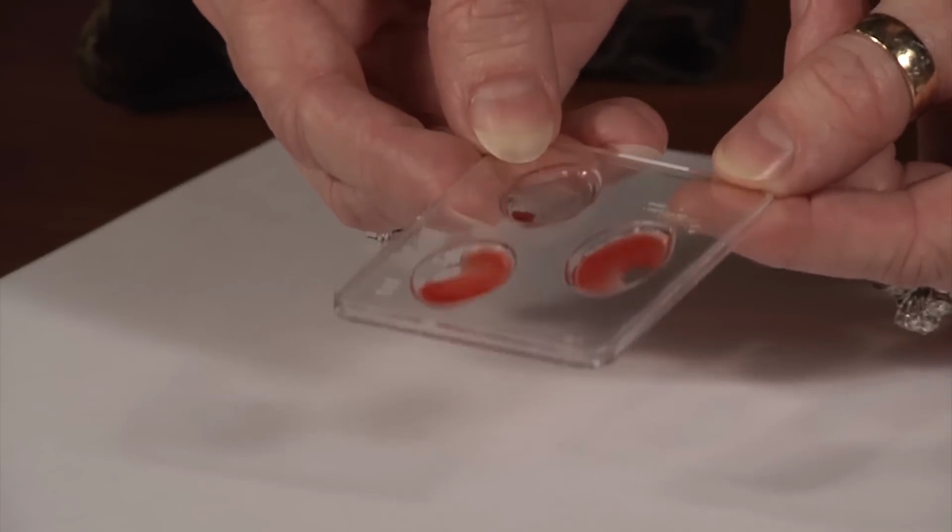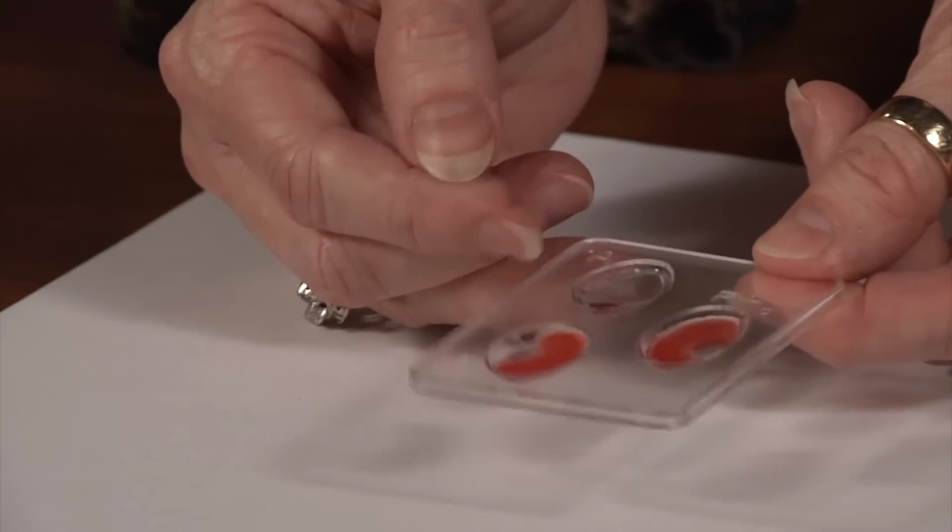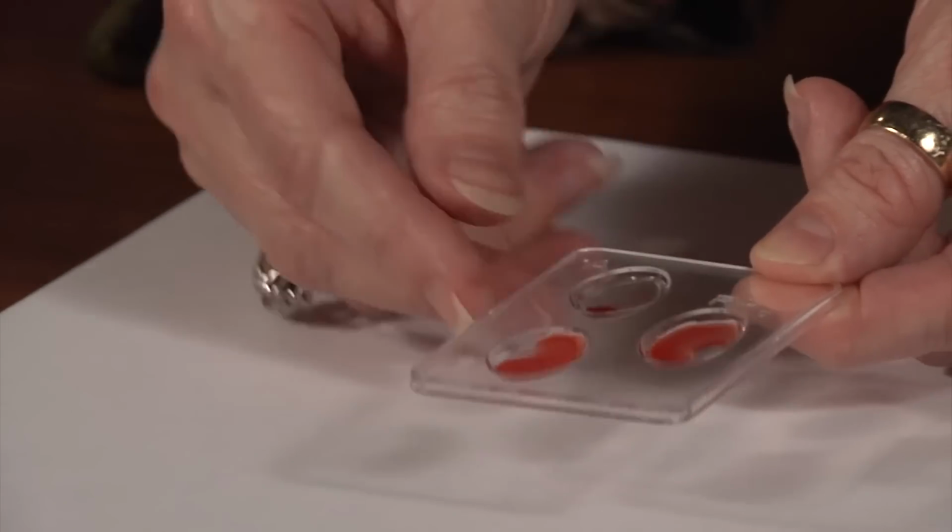And as this sits, you will see that the agglutination becomes more and more obvious. And after several minutes of sitting, you'll see that the RH and the A both have agglutinated. So this should tell you from your previous knowledge that if you have agglutination, that means that the same type of antibodies and antigens are present in that well. So because we have agglutination, we know there are A antigens. Because we do not have agglutination in the B well, we know there are no B antigens because we put B antibodies in there in our serum.